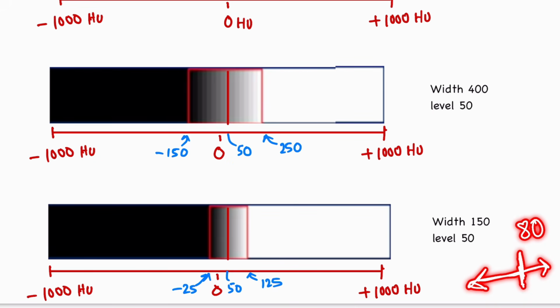So it is minus 90, it is minus 10. So anything above minus 10 is going to look white. Always remember this. It is not just the absolute value; whether fluid will look white or fluid will look dark, it all depends upon your windowing.